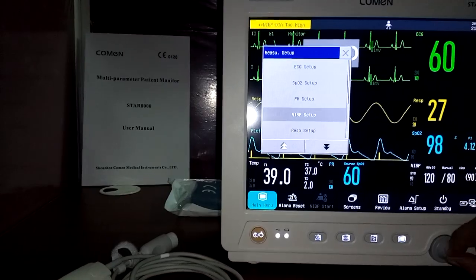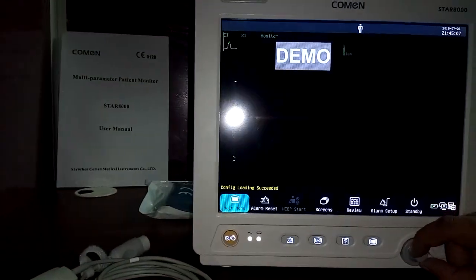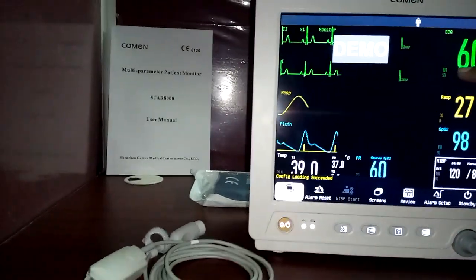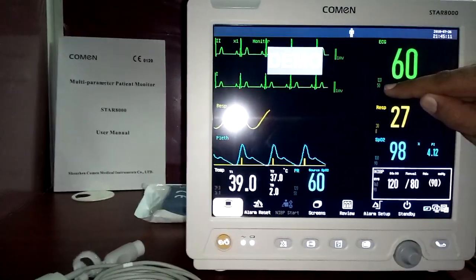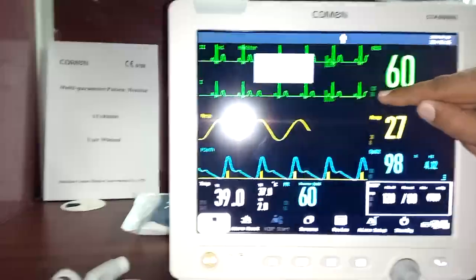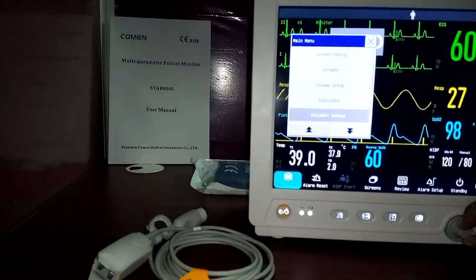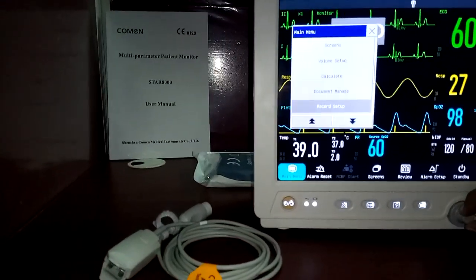Switching back to normal adult settings: the ECG alarm limits return to 50 (lower) and 120 (upper) for heart rate. You can see the alarm limits update immediately when the patient type is changed.